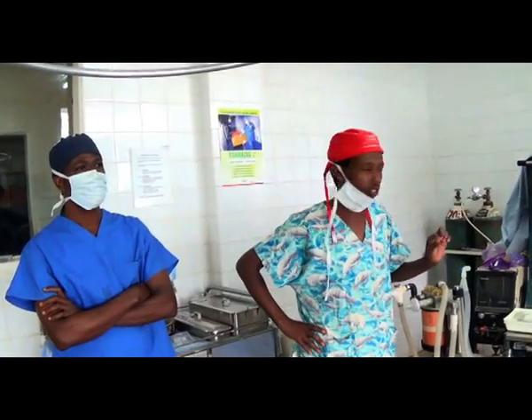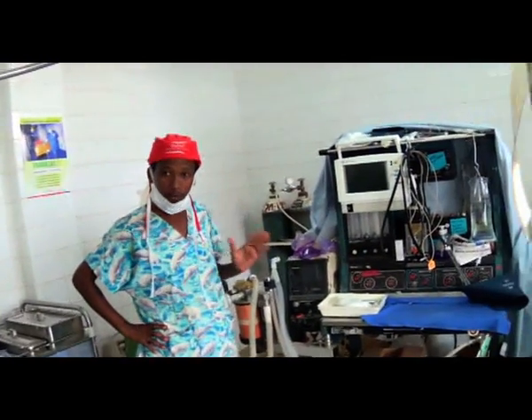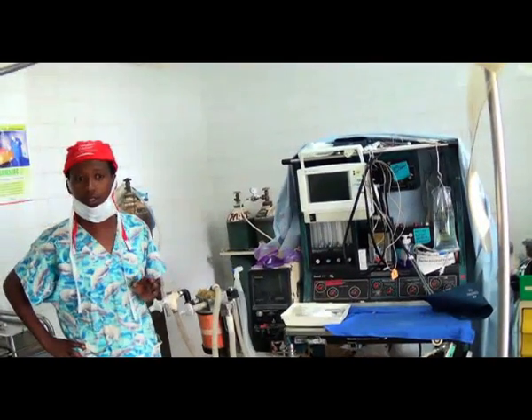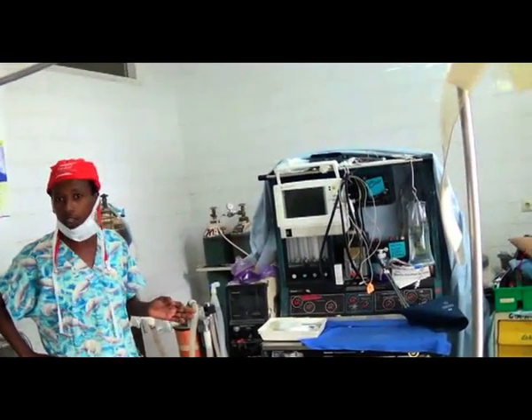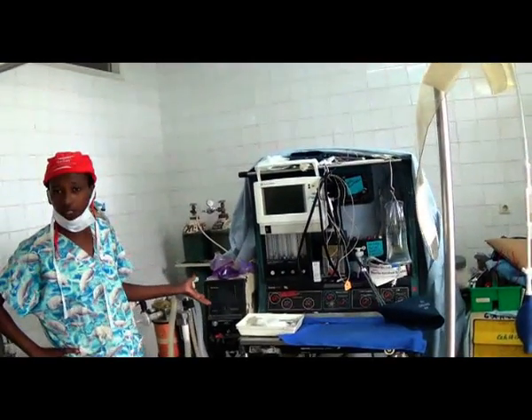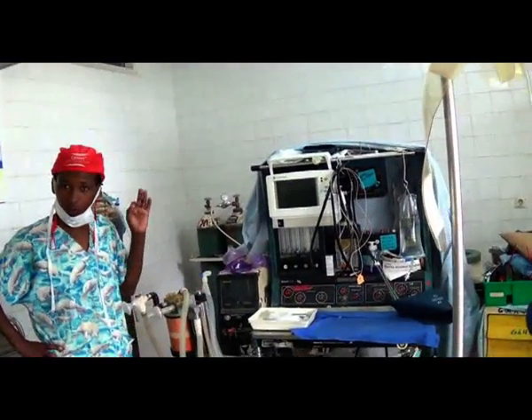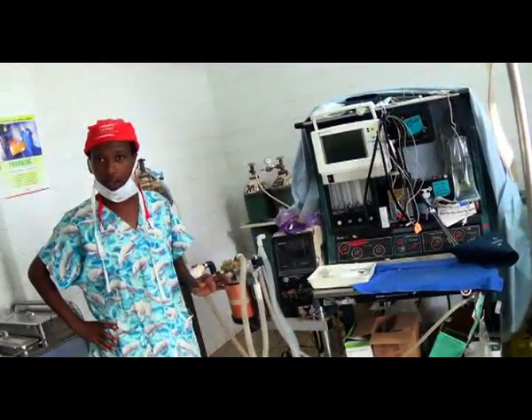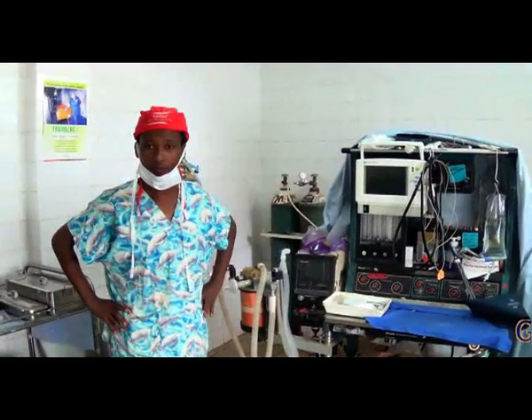But in general, this anesthesia machine should be available in the OR, whether it is minor or major, because we don't know what will happen to the patient. A minor thing will complicate and go to a major operation, so it should be available for every procedure that is going to be done in the OR. Thank you so much, Mr.